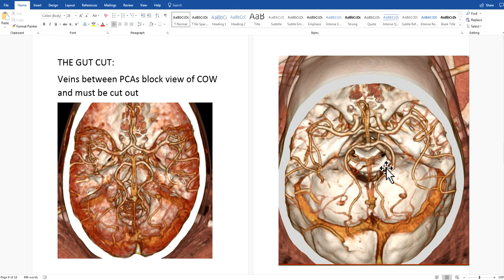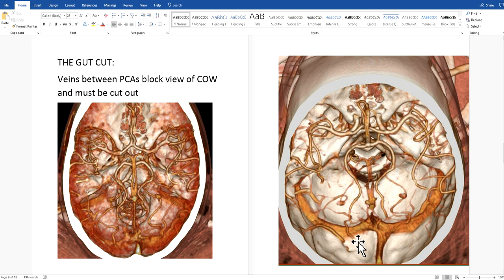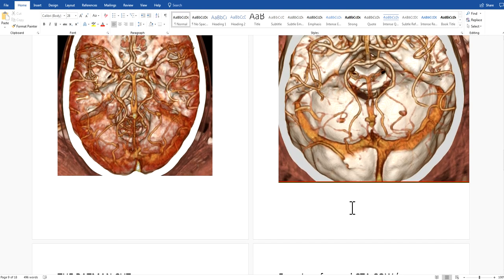We can't just cut the veins out right there or we'll cut out the basilar artery and posterior cerebral arteries. So you take this image and tilt it back — grab the front of the head, tilt it back, and these veins move out of the way. Tilt it back and position it until you can see the veins between the posterior cerebral arteries and off of the basilar artery. Then make the gut cut — carefully come in along the posterior cerebral arteries, across the middle, and back out, scooping the veins out. That's a very important cut.